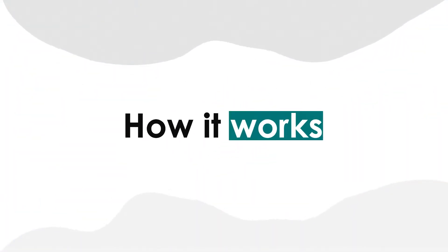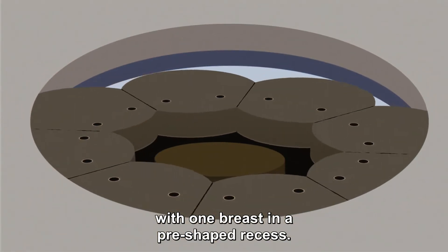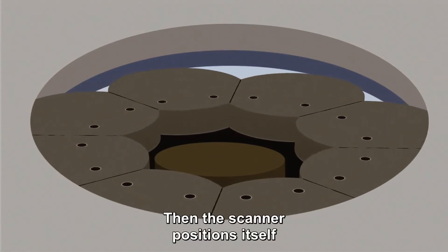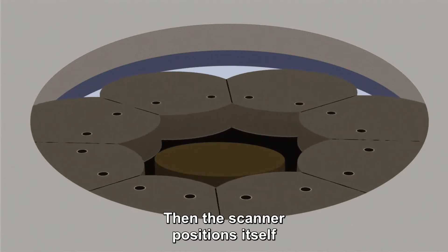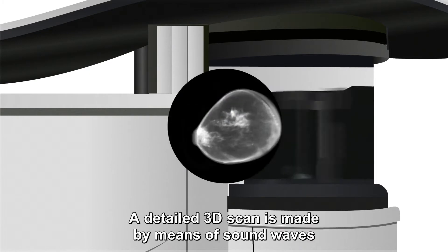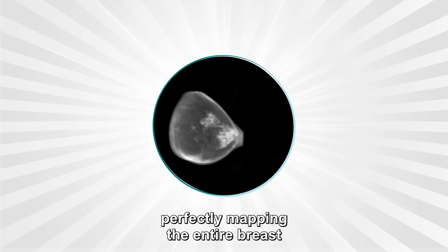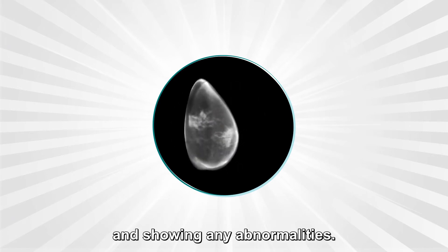How it works: the woman lies on a soft table with one breast in a pre-shaped recess. Then the scanner positions itself and rotates 360 degrees around the breast. A detailed 3D scan is made by means of sound waves, perfectly mapping the entire breast and showing any abnormalities.